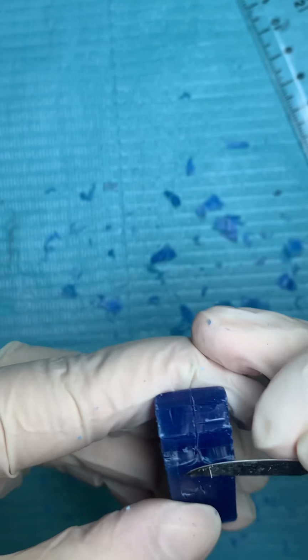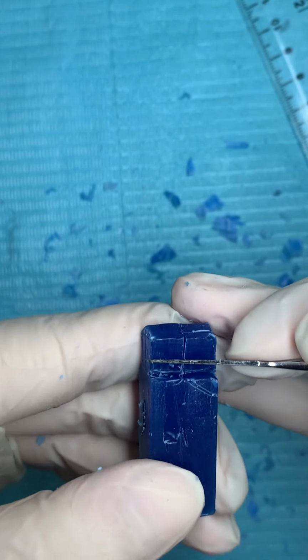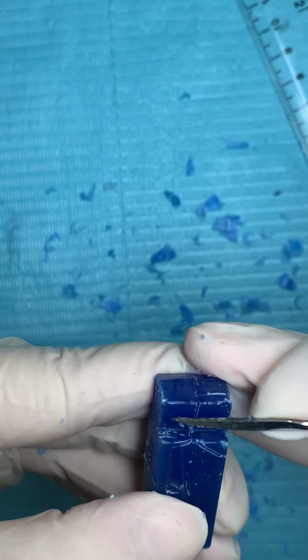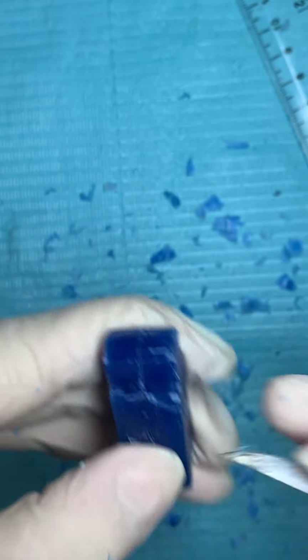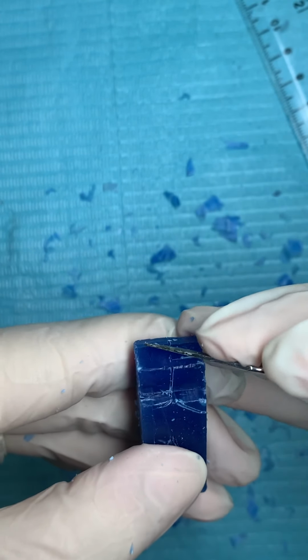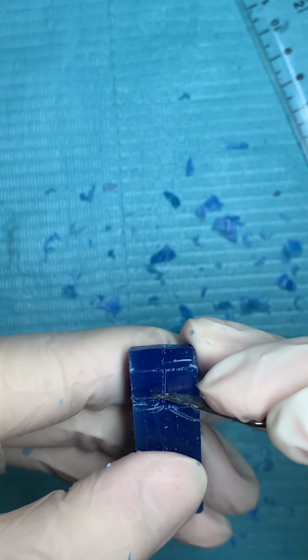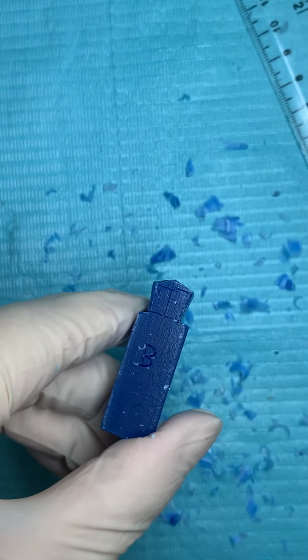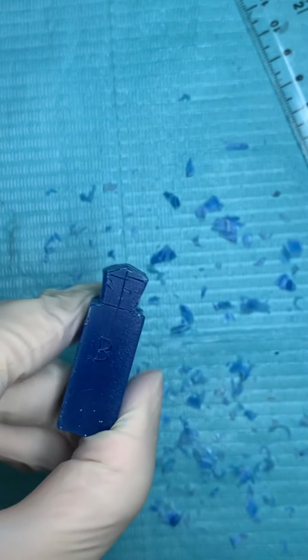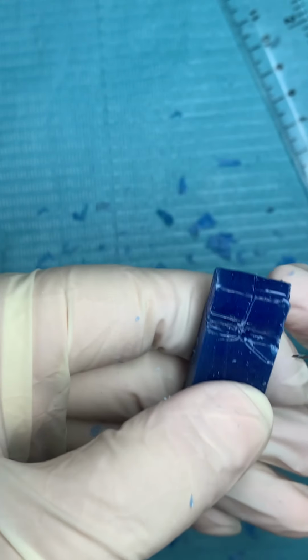In the buccal side, I will make my height of contour, which is the maximum convexity. As I told you, it is in the cervical third, and in the mandibular teeth, it is below the cervical third, maybe at the cervical fourth. So if my measurement here is 8 millimeters, I'm going to measure 2 millimeters from this cervical line. Measure 2 millimeters here in the buccal, right? The buccal part here, it is 2 millimeters.